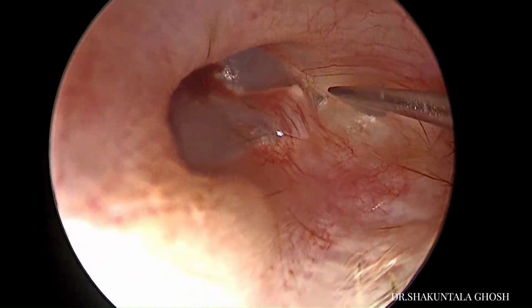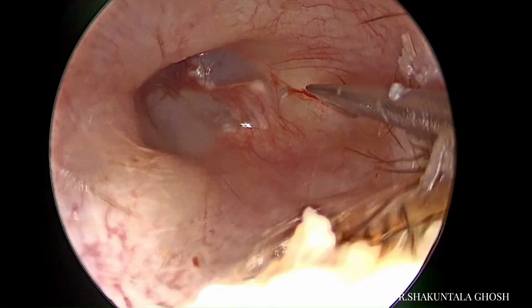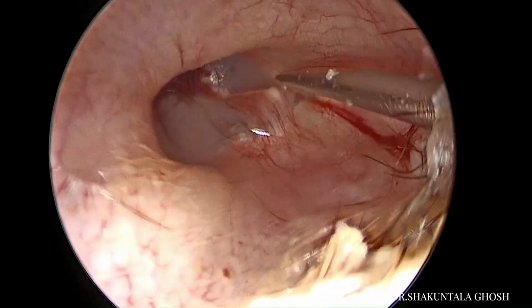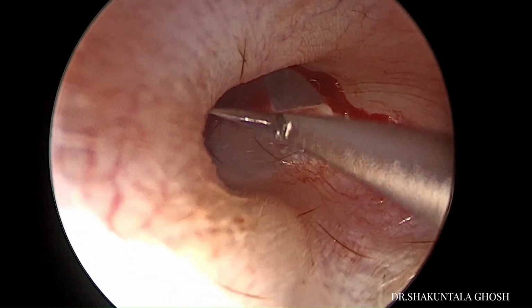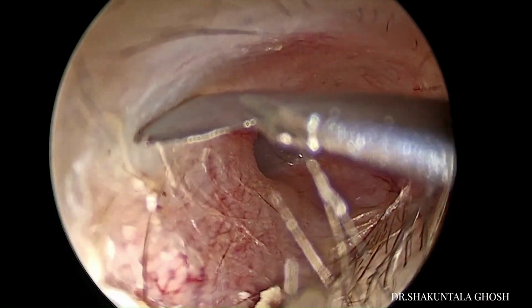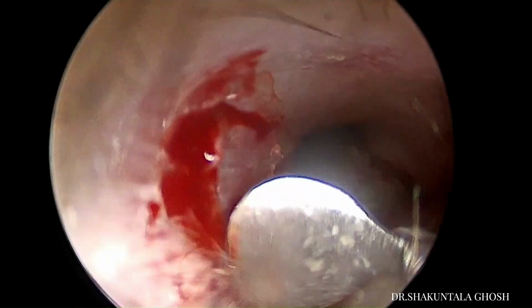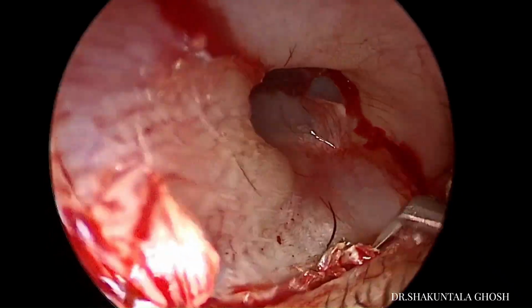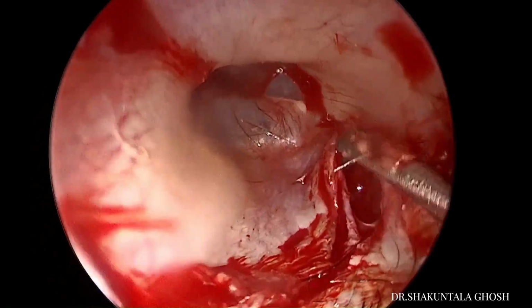So starting the surgery using a 0-degree nasal endoscope, which is 4 mm diameter, placed in the left side ear canal after a thorough irrigation and removing of debris, and using the flag knife I am making the radial incision at 12 o'clock position. This is the left ear, and then again at the 6 o'clock position, starting from the annulus and coming about 6 mm laterally, and then using a horizontal incision to join both the radial incisions up to bone depth. This is to raise the posterior tympanomeatal flap.